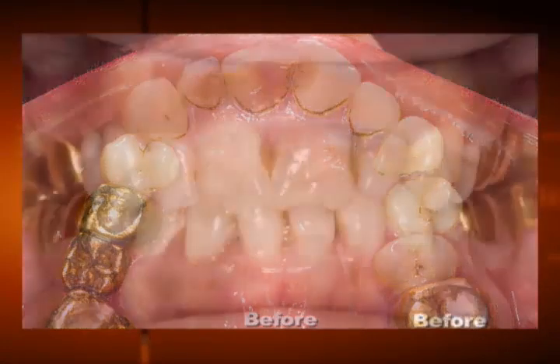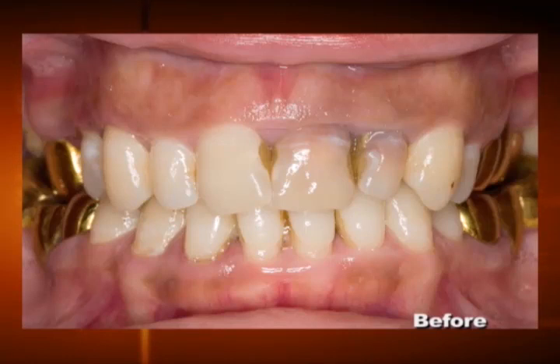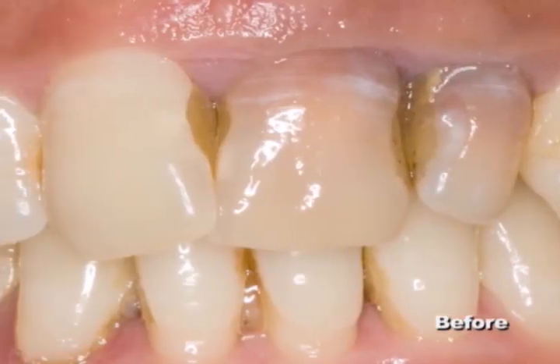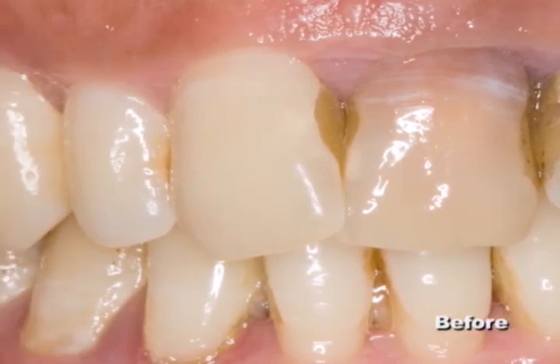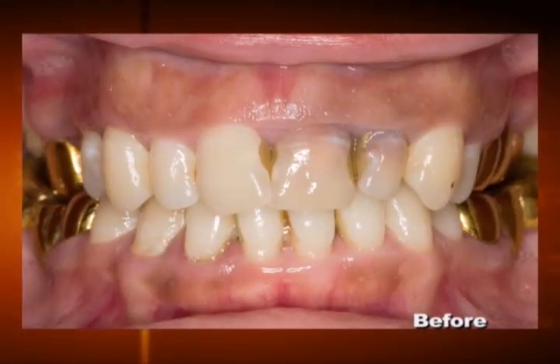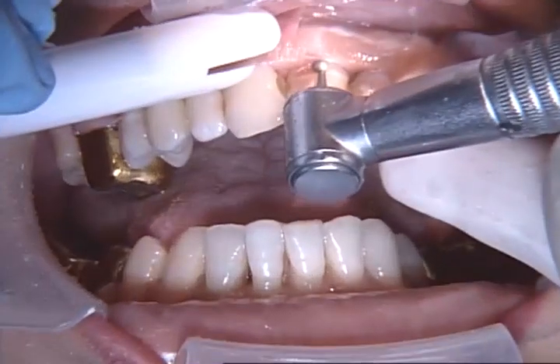They're really just like our old anodized shells, and they're filled with the same kind of reline material. We've had endodontic therapy done on teeth number 9 and 10, and you can see they're starting to turn kind of dark. We've got some old failing composites in between the teeth, some radiographic caries, some recurrent caries around those old gold crowns on the top. And so we're going to begin just by cleaning everything up and seeing what we have here.